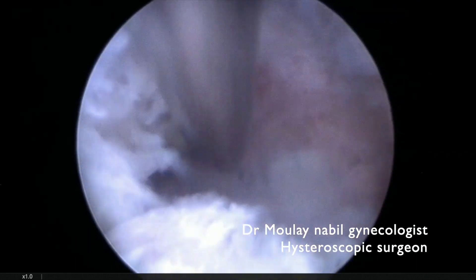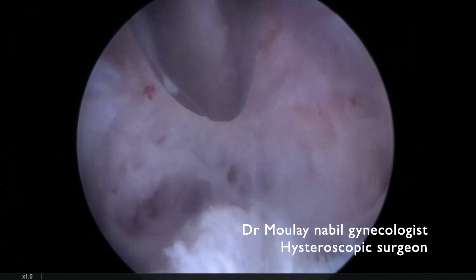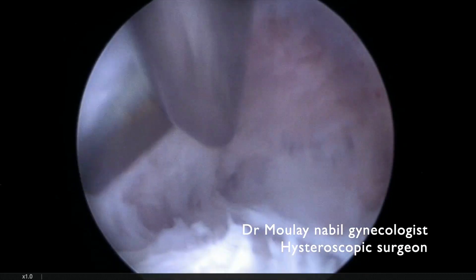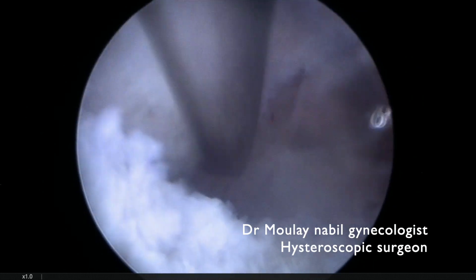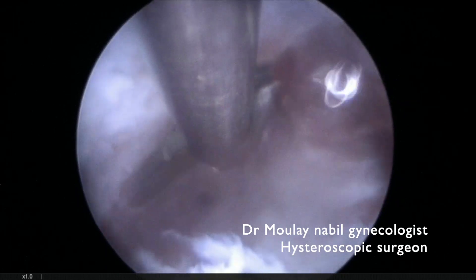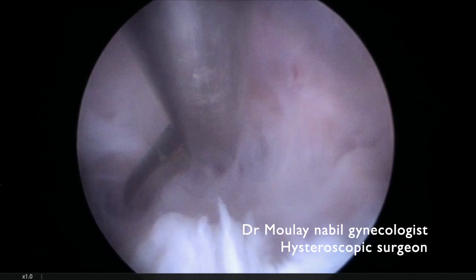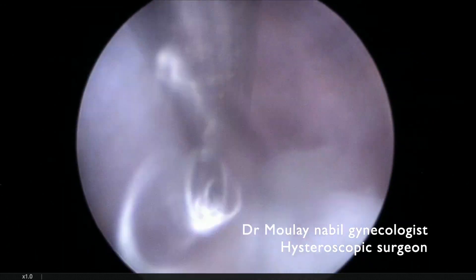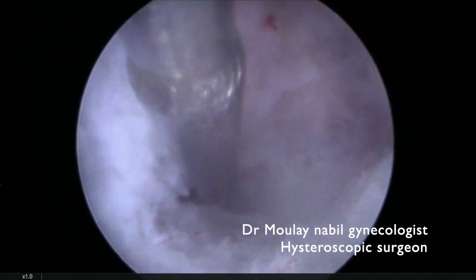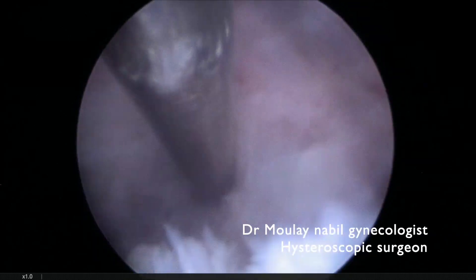If you are in the synechial tissue, there is no bleeding, and you can cut the tissue easily with no risk of perforation. As you see, we increase the uterine cavity volume laterally, and we can see that we arrive at the vascular tissue. You can see a small hint of bleeding — that means the lateral section is sufficient.